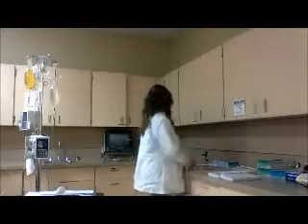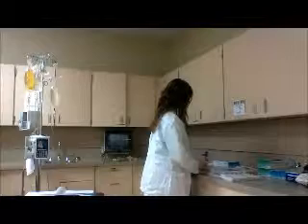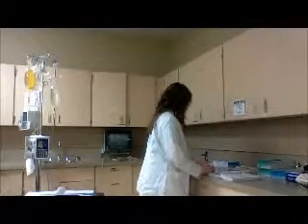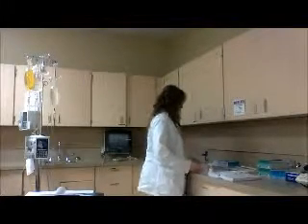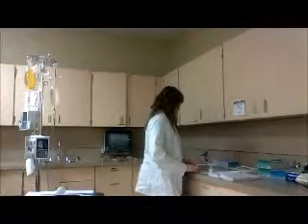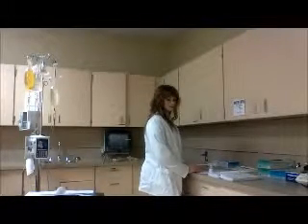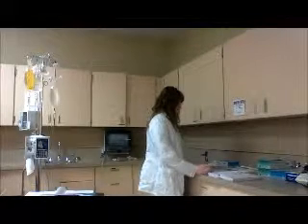Alright, so I'm going to gather all my supplies, and I'm going to draw heparin in a TB syringe. I've done my math here. I need 75 units per kilogram, and I know that my patient weighs 110 pounds, which is approximately 50 kilograms.